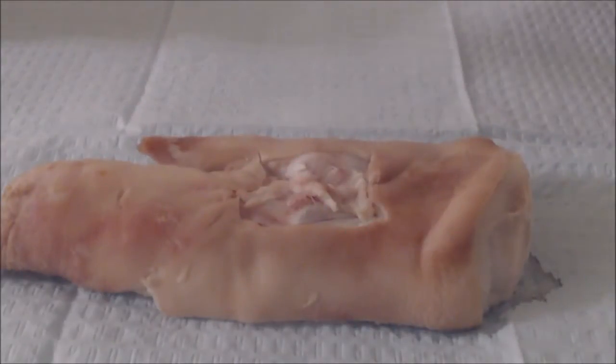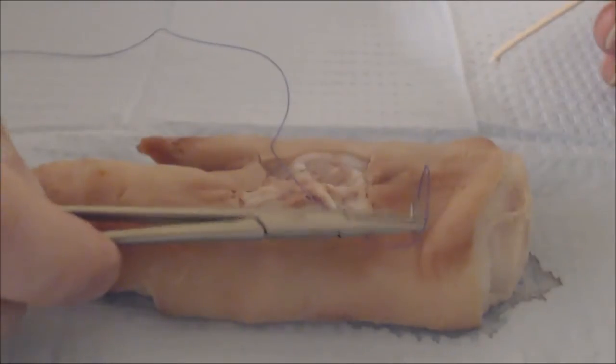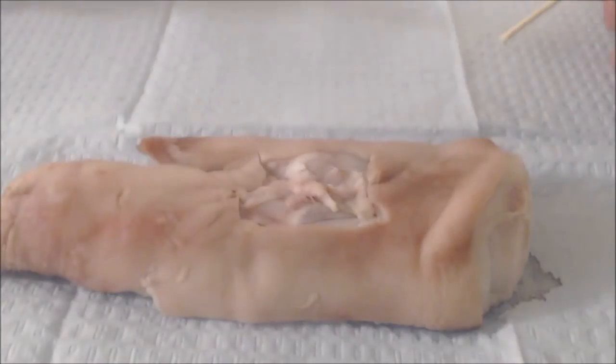Venous bleeding can sometimes be very difficult to control — you can't really see where it's coming from. We'll practice a figure-of-eight suture, which is a hemostatic suture for controlling venous bleeding, using this pig's foot.